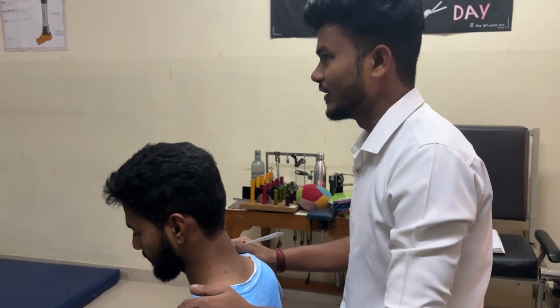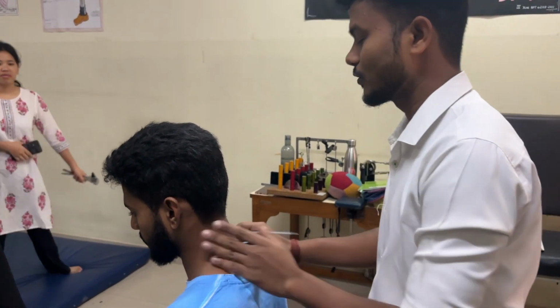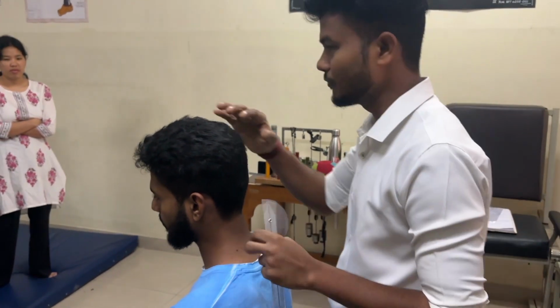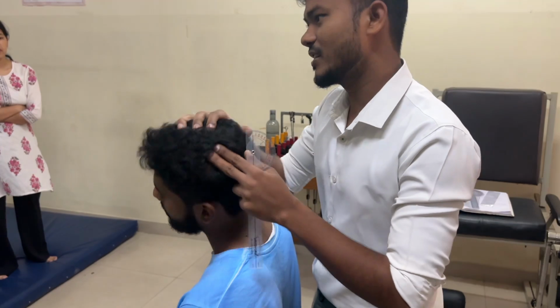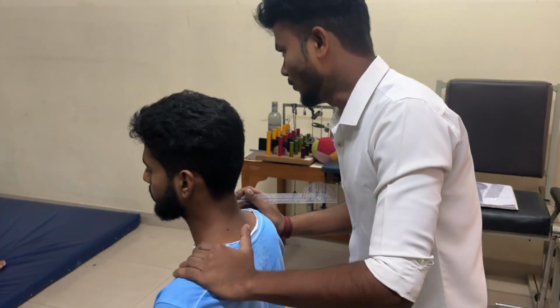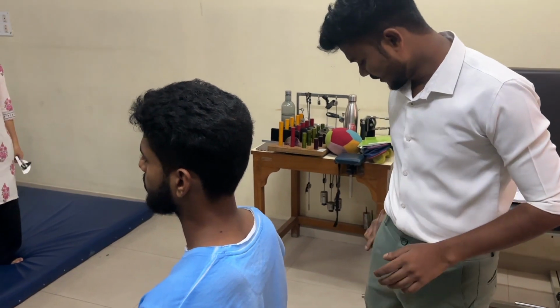We are starting with spine ROM. Now we will see cervical spine range of motion. So we know the movements now. Cervical spine ROM: we have flexion, extension, lateral flexion, side flexion, and rotation. So first, cervical spine range of motion. We will see flexion first.